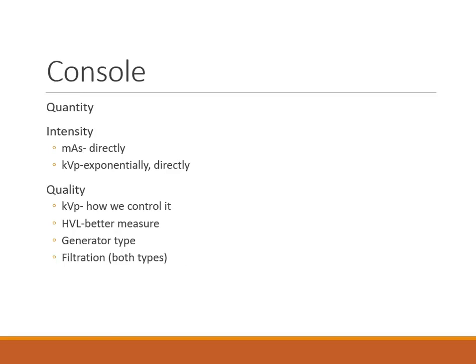Also, as the tube ages, remember what we have is tanning. And tanning is laying down of more inherent filtration on the inside of the X-ray tube as the filament vaporizes. So every 6 months to a year, the physicist has to come in and make sure that the kVp and the mAs that you set give you an accurate kVp and an accurate mR to mAs output.